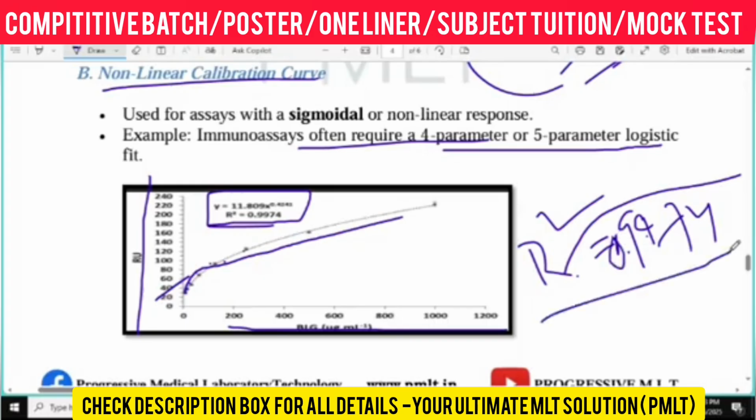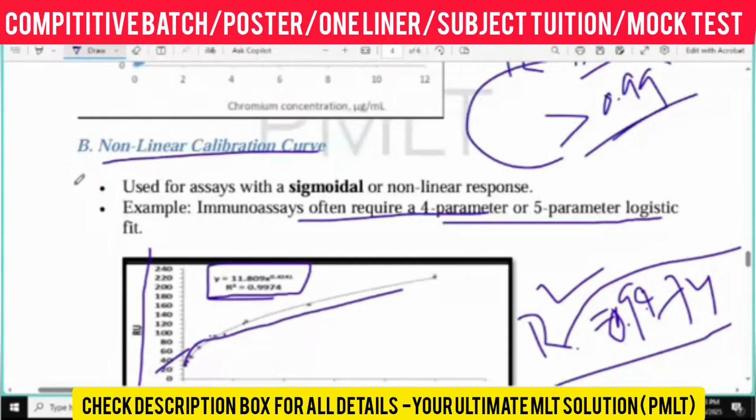Is it higher or lower? Higher, so we can check the value of the calibration curve. Understood? How the R square is calculated, I have already told you. If it's less than 0.99, you cannot take the result. Then you have to run the calibration again. Understood?